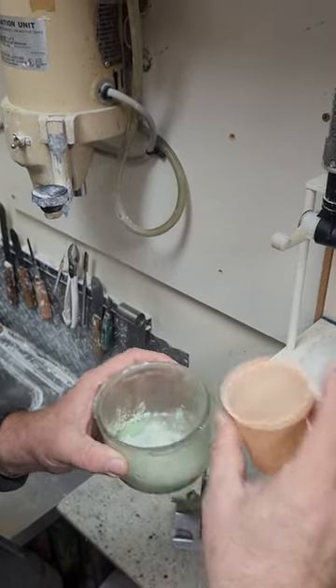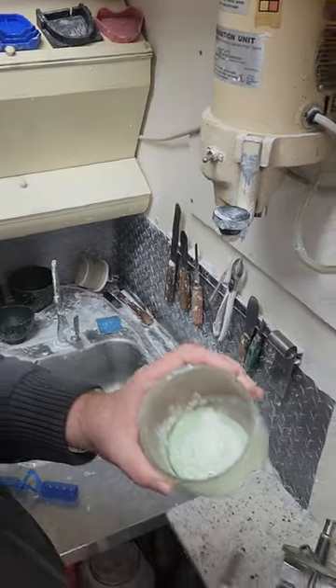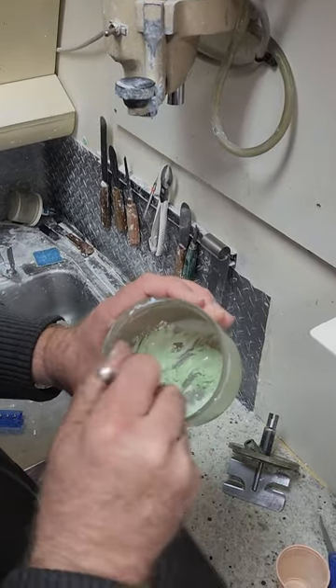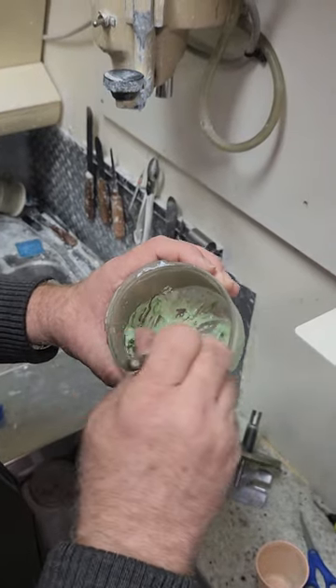We add our 50 cc's of stone and now we're going to mix it together. It should get to a fairly stiff yet creamy consistency.